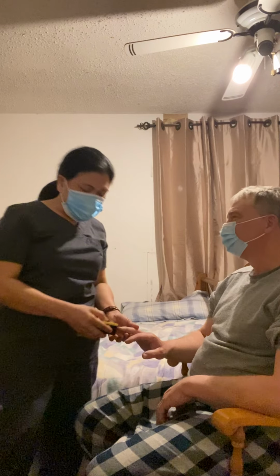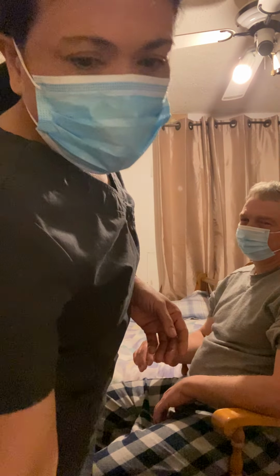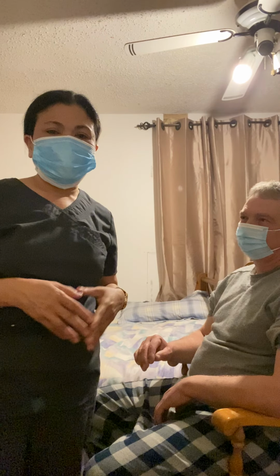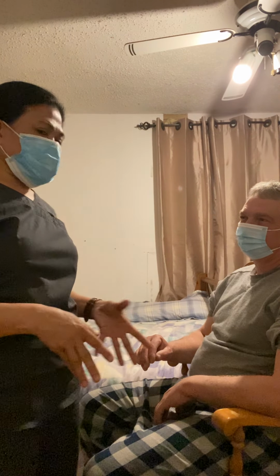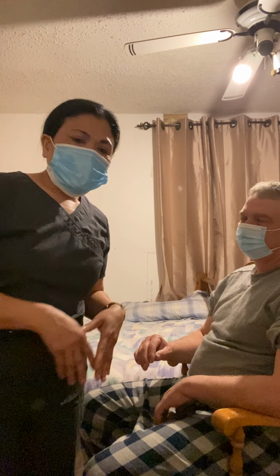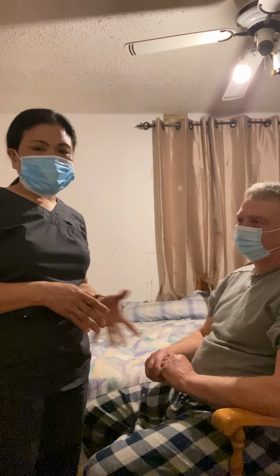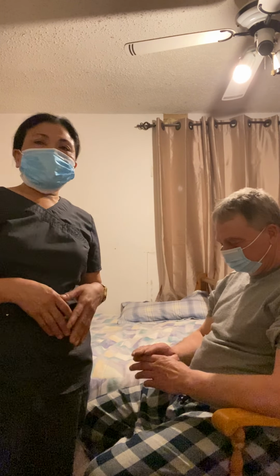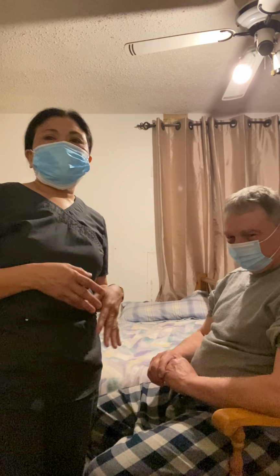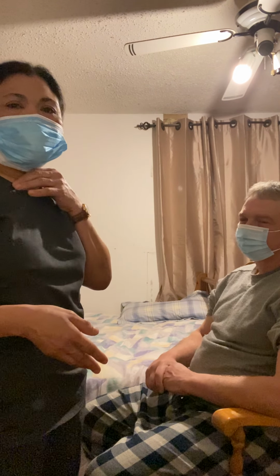So the patient has 96, and the normal oxygen saturation is between 95 and 100%. So we will clean the device and then document our findings. And then the next thing we're going to do is take the patient's pulse.